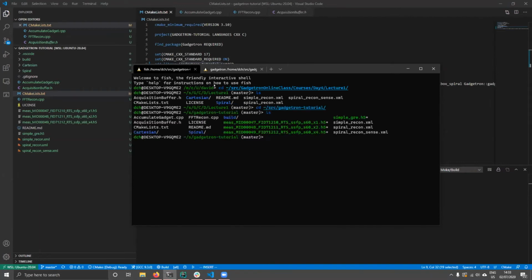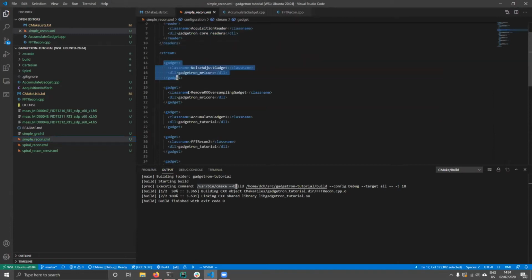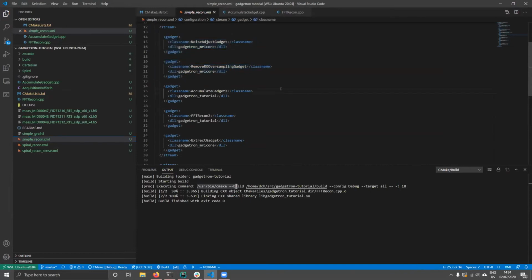And then let's see. Oh, right. Last thing, we have an XML file, which includes an acquisition reader. I've added a noise adjust and remove oversampling gadget. And then we have an accumulate gadget, which we made, and FFT recon gadget.